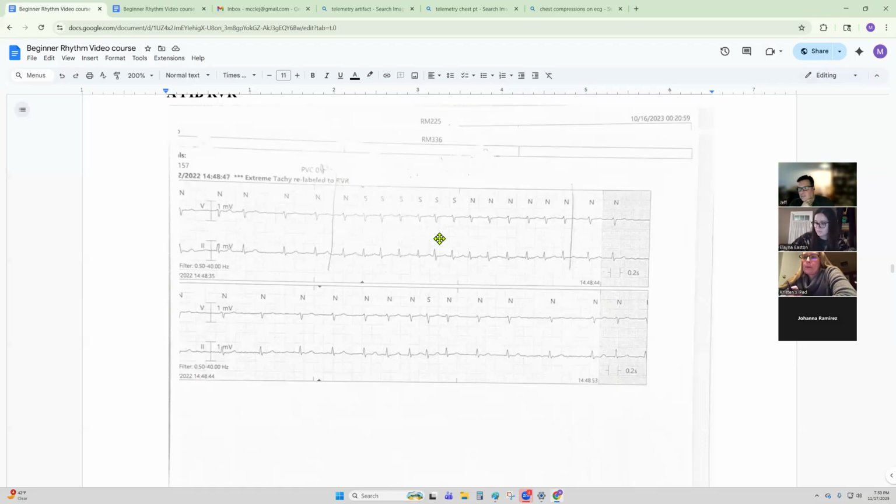Is MAT a WAP over 100? It's not, Joanna. And I know we said that for a long time, but a wandering atrial pacemaker is ectopic pacemaker cells, where the normal pacemaker cell of the heart is the SA node, and with a wandering atrial pacemaker, it's competing pacemaker cells, where you go from SA node, atrial chamber, junctional.